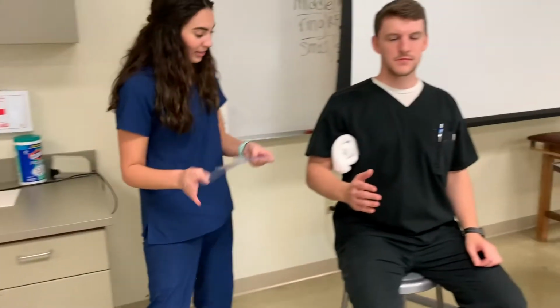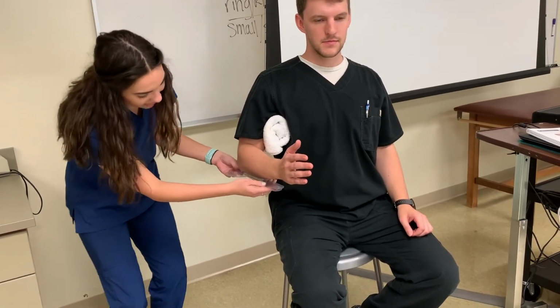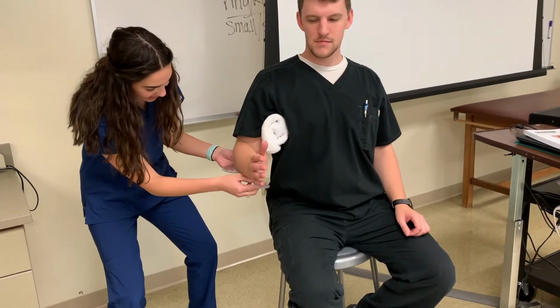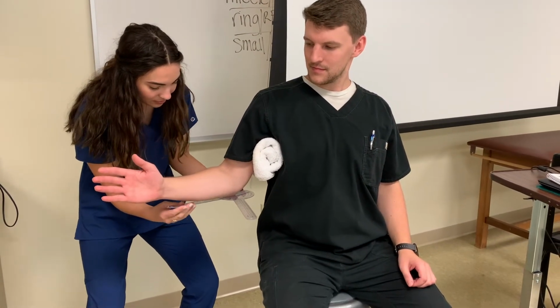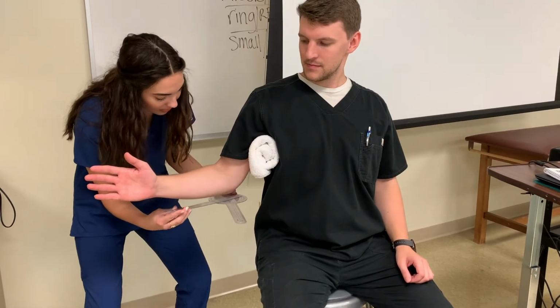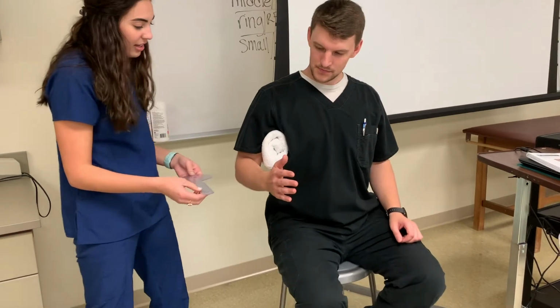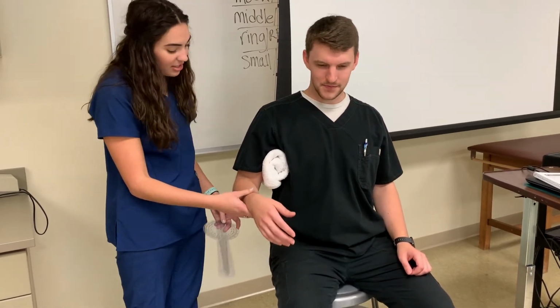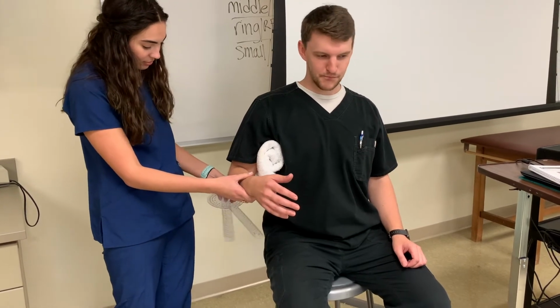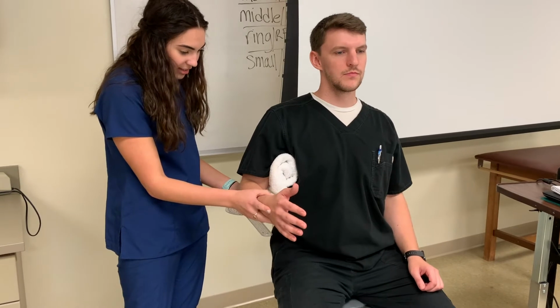Next, the practitioner should palpate the olecranon process and place the fulcrum or the axis of rotation on the olecranon process of the ulna. The stable arm should be parallel with the lateral midline of the ulna. The movable arm should be parallel with the lateral midline of the ulna as well. The practitioner should instruct the client to move your hand away from your stomach. Then the practitioner should measure and document.